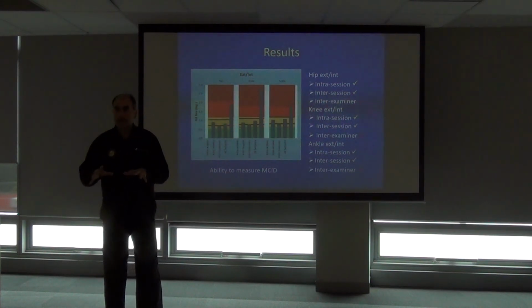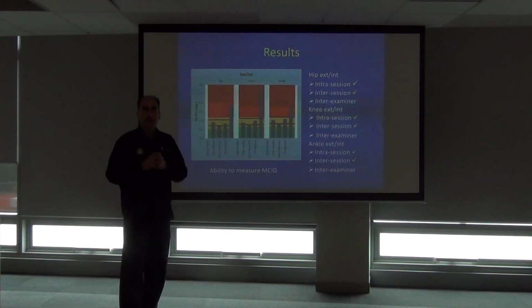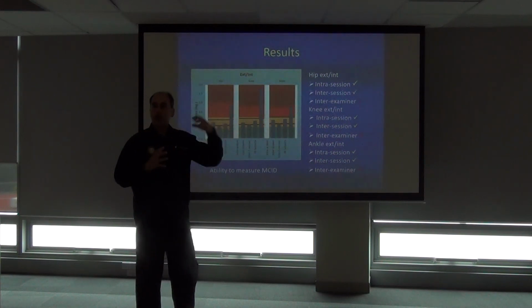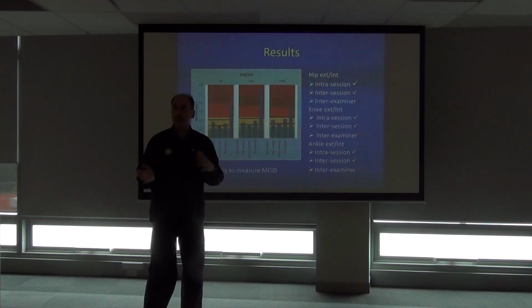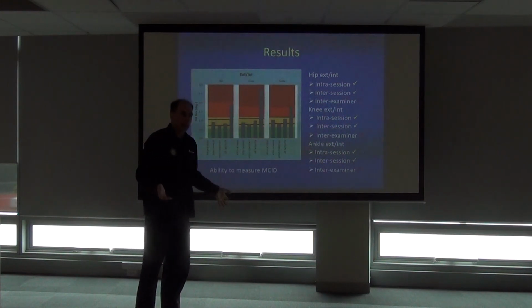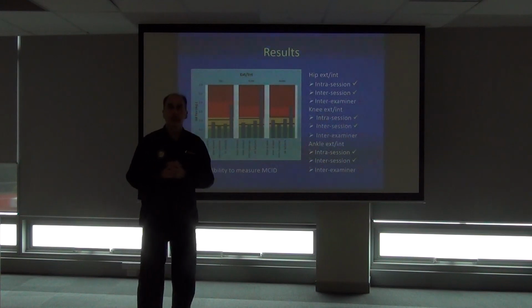If your axes are out, it'll show up in your rotations, and the partitioning of moments into these planes is also out. We've seen large variation in axis alignments and in the angles calculated, and therefore large variations and inaccuracies in the moments, because your axes aren't correct.